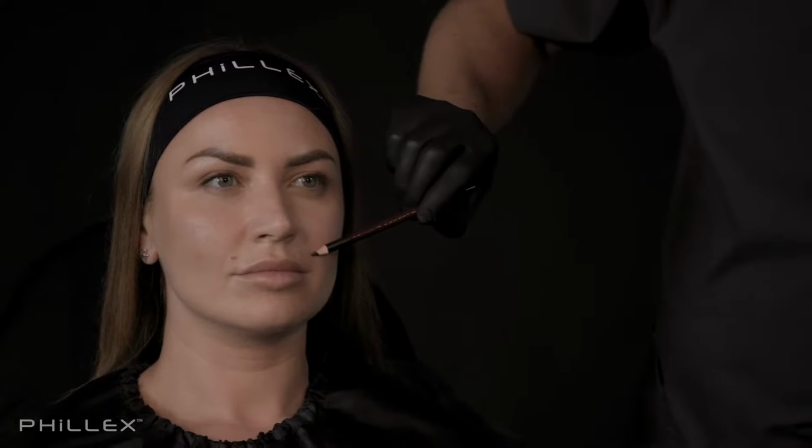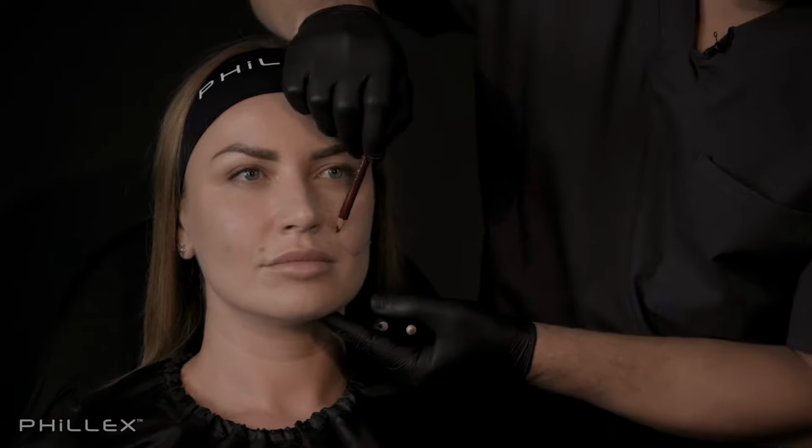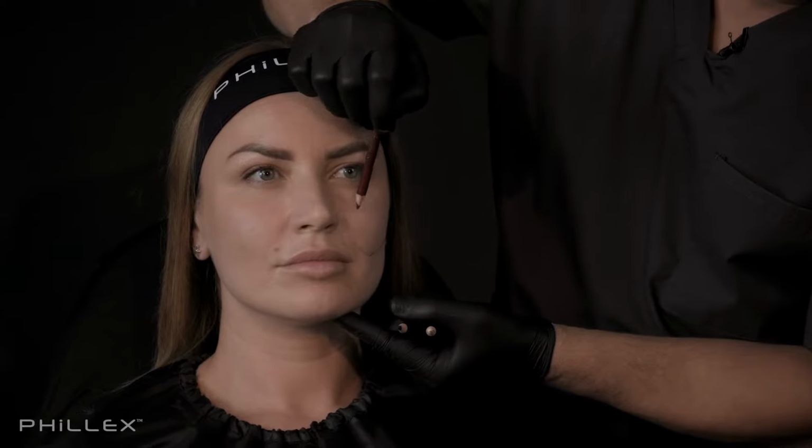I will show this with the help of our model. So, our model Nadia, 36 years old. Well, we all understand she is young enough, but anyway, even at that age of 36, she has slight signs of age changes. What we can see, you can see the shadows that are here, and we understand the shadow is too low, and we need to put it up. What do we have to do?